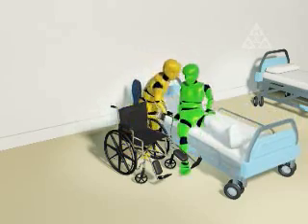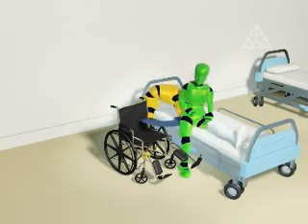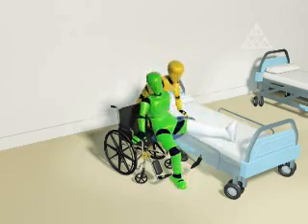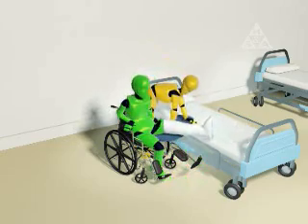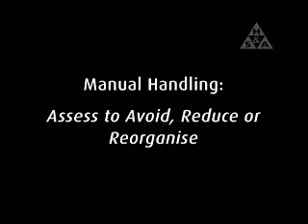This has eliminated the need for the patient to stand upright on the floor, and in doing so has reduced the risk of injury. The risk of injury to the carer has also been reduced, as the amount of manual handling involved has been decreased significantly. Manual handling. Assess to avoid, reduce, or reorganize.